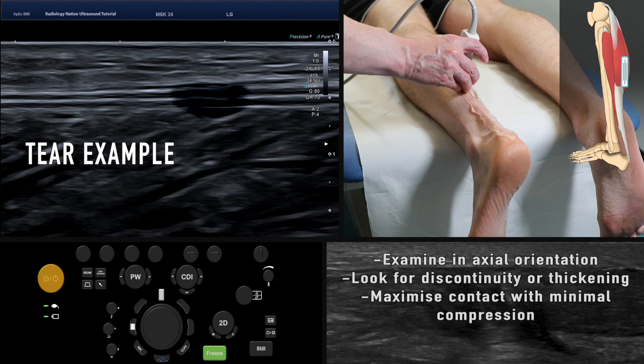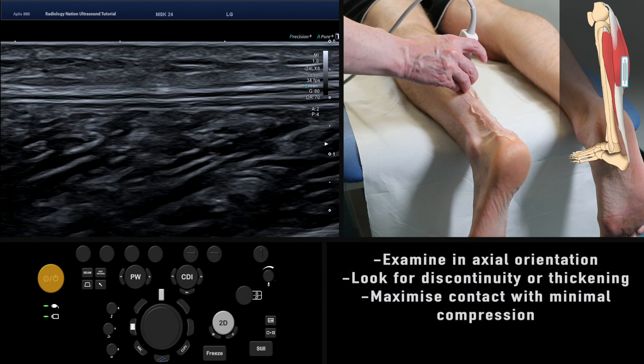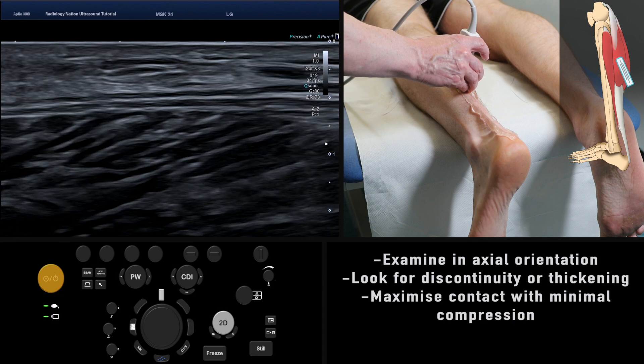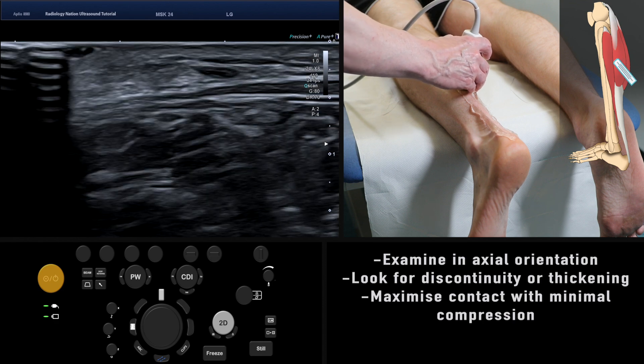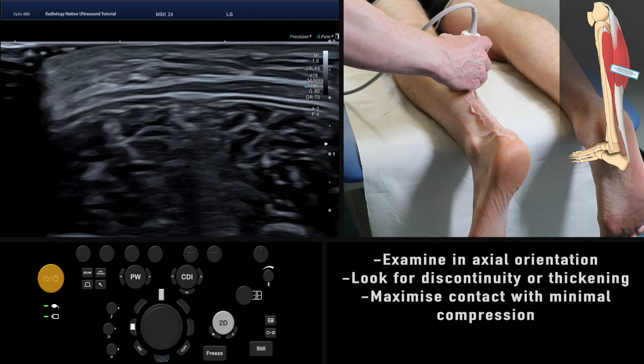Once assessment in the longitudinal plane has been completed, turn the probe through 90 degrees and slowly move the probe distally, assessing in the axial plane back down to the insertion on the calcaneus.